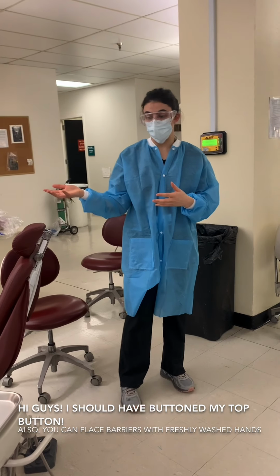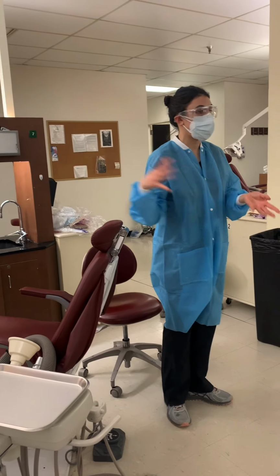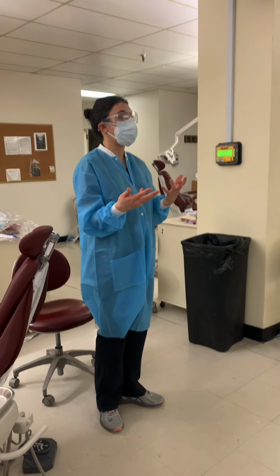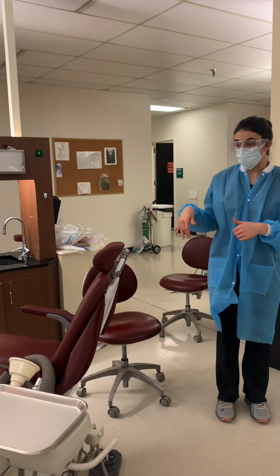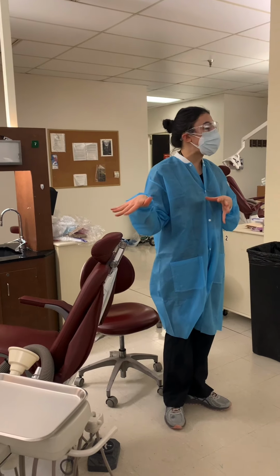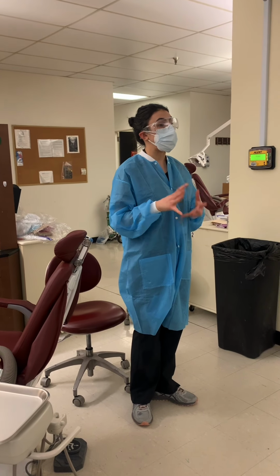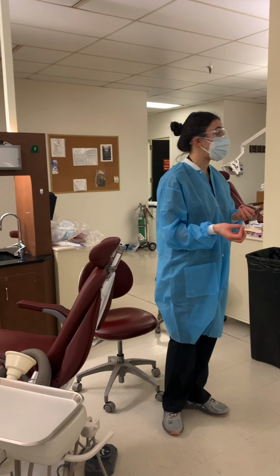We're going to assume that this unit has been pre-wiped. Let's say we were just here before lunch. It's only been sitting a half hour, so it's clean enough to just start barriering and bring your patient back. So in order to set up the room to bring your patient back, some of the frequently touched areas we like to cover with plastic barriers because it just makes it easier for disinfection and wiping at the end.